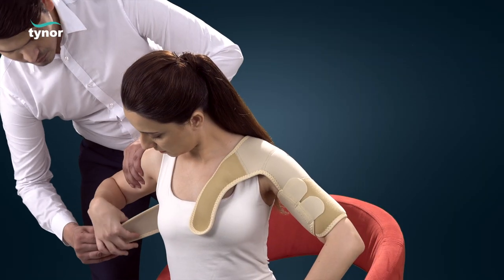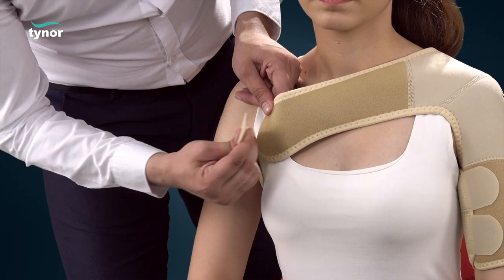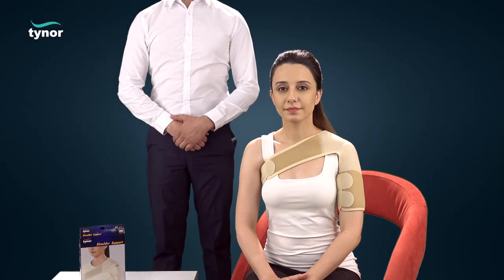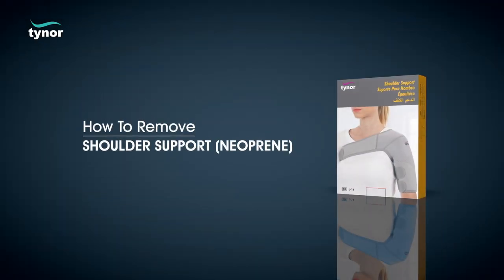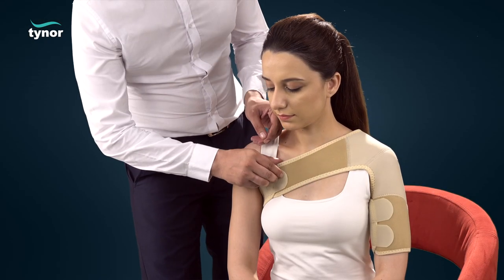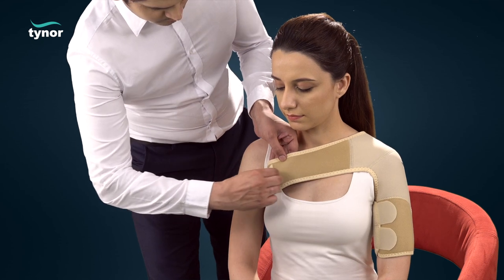Apply the strap under the positioned arm and close it in the front. To remove the shoulder support neoprene, the product can be easily removed by unfastening the hook and loop straps.